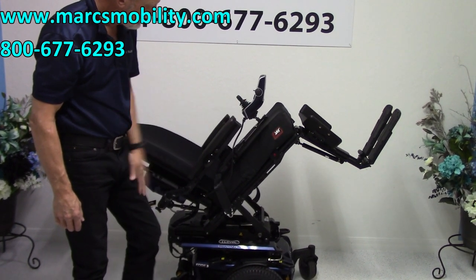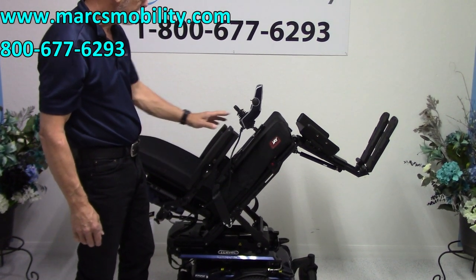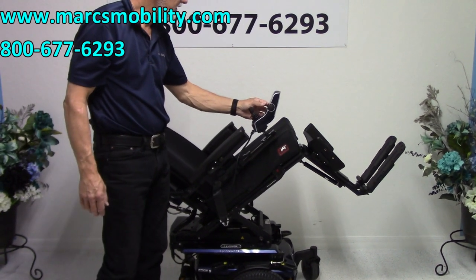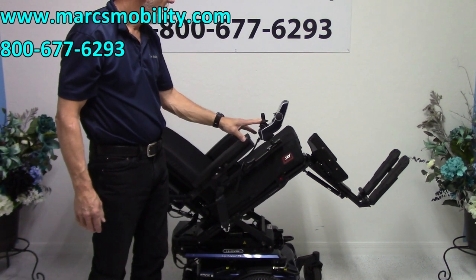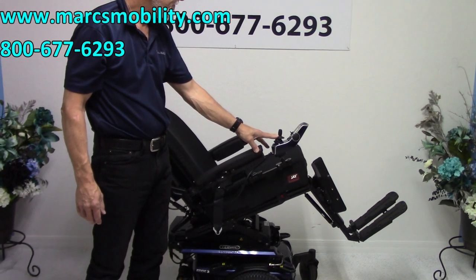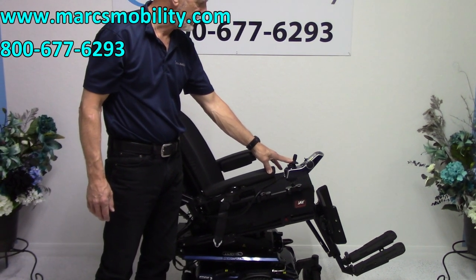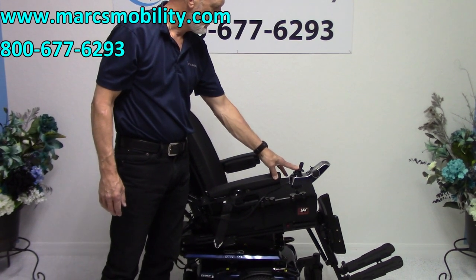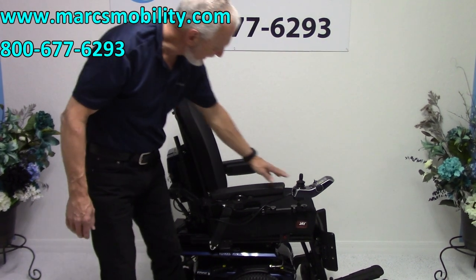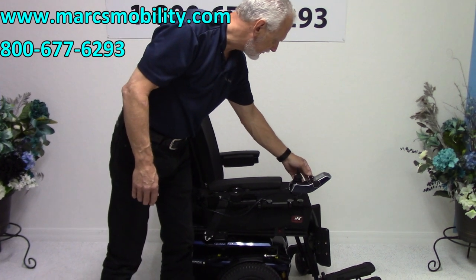If you want it to be tilted, this is where you would be — tilted. That's your full electric tilt. I'm going to bring it all the way back down. Now, we're going to put it back and drive.